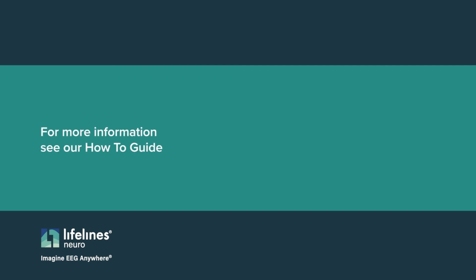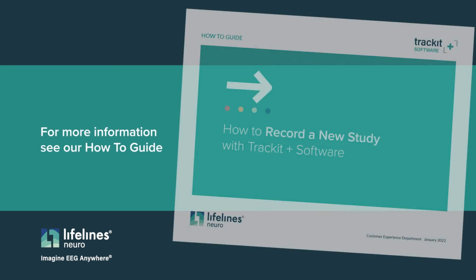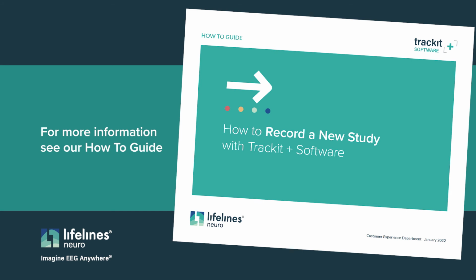For a closer look at recording a new study, see our in-depth how-to guide on our website's technical support hub.